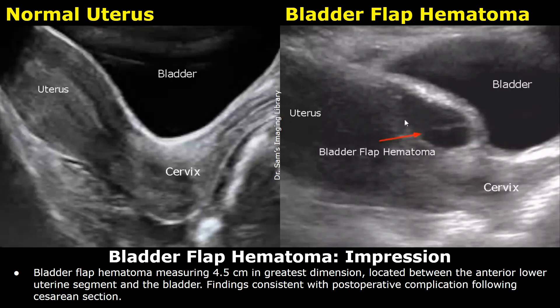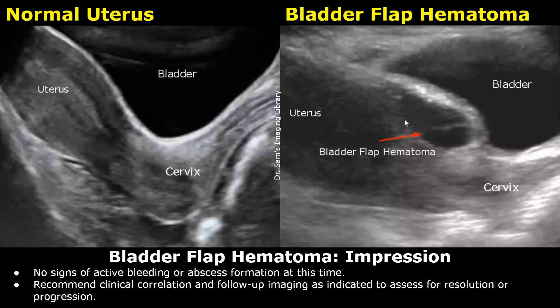Impression: bladder flap hematoma measuring 4.5 cm in greatest dimension, located between the anterior lower uterine segment and the bladder. Findings consistent with postoperative complication following cesarean section. No signs of active bleeding or abscess formation at this time. Recommend clinical correlation and follow-up imaging as indicated to assess for resolution or progression.